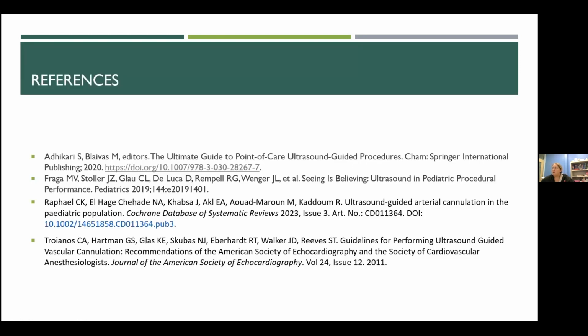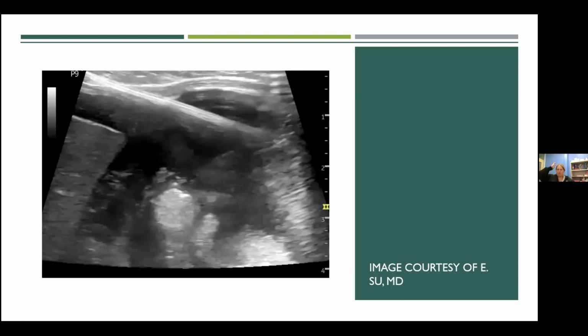So these are procedures that, again, I think many of us do central access and arterial access on a really regular basis. Paracentesis and thoracentesis are maybe a little less common, although if your units are anything like ours, we've been doing chest tubes left and right this winter. It seems like everyone has an empyema. So I'm trying to encourage people to use ultrasound, to remind them that it does have value and that you can make your patients' procedures safer and more efficient, and just reminding them that this is a tool that has been studied, and with use comes comfort.